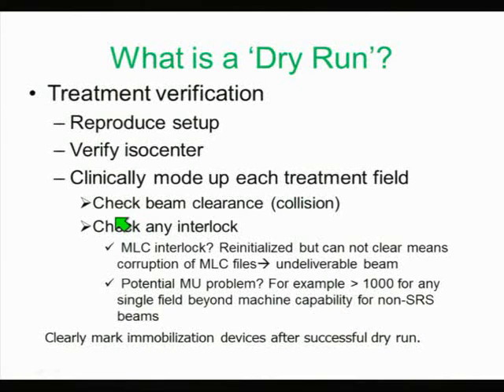That is the only way you can check every single beam for clearance and collision. Whether there's a collision, whether there are issues, and you can check any interlock that comes up in the clinical mode. If you don't run it in the clinical mode, you think everything's fine, but it could run into problems when they run it in the clinical mode, because clinical mode is the most sensitive for the machine, it checks the most, so that part you cannot skip. And we actually discovered lots of things during this process.